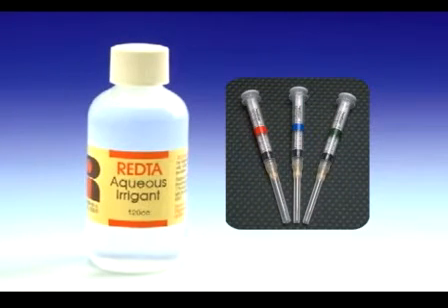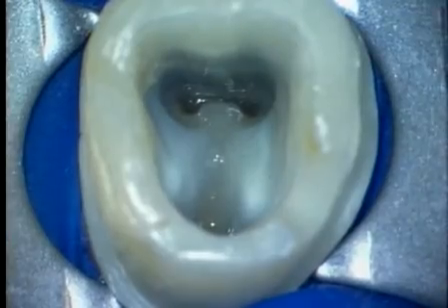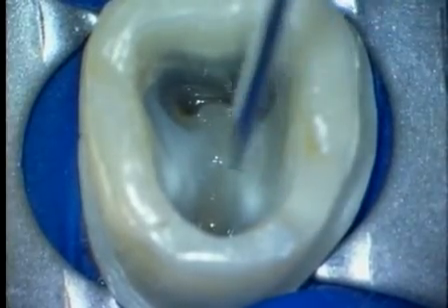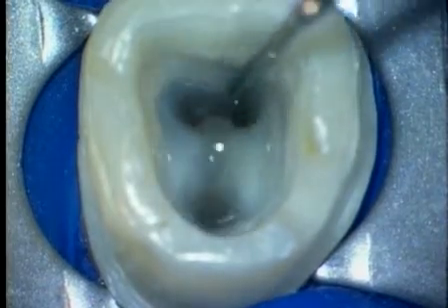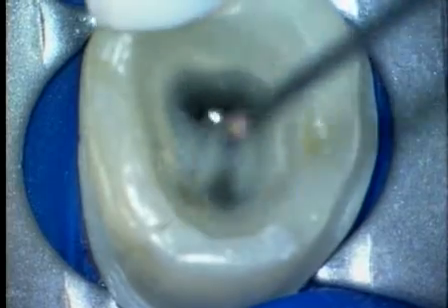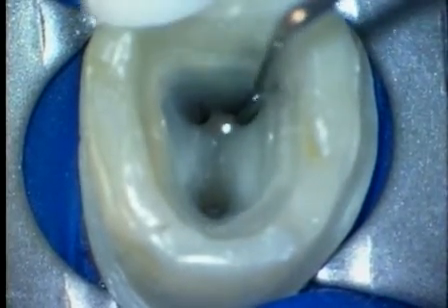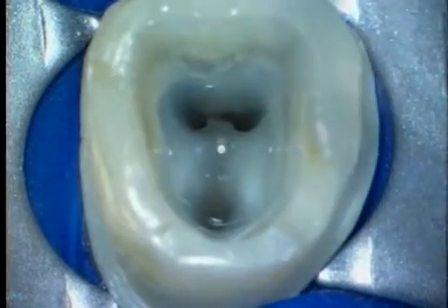Labeled syringes are important so that we always know what we're introducing into a tooth. Clinicians should irrigate with EDTA during and after canal preparation procedures. Some activate the irrigant with hand files, whereas others use ultrasonic devices. The problem with ultrasonic devices is they can cause defects in the canal wall.